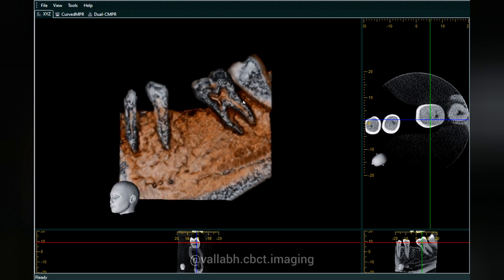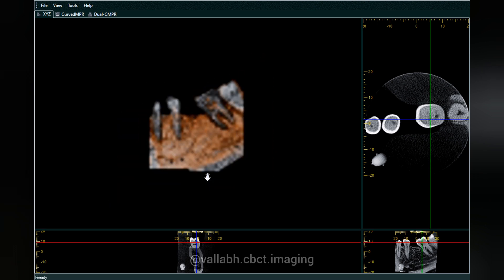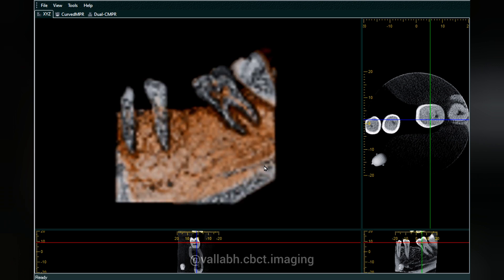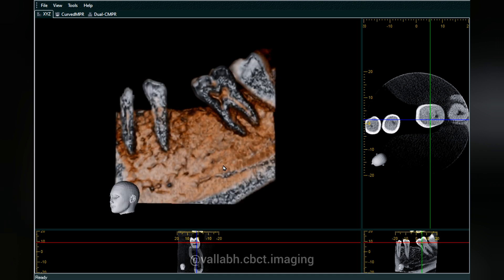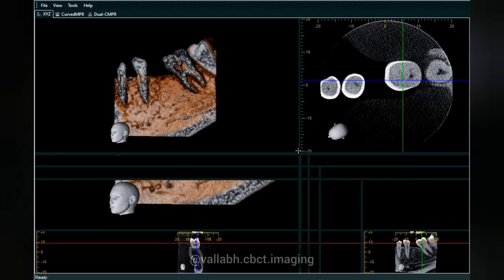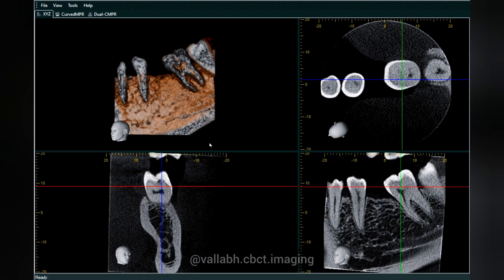This area is used to check the bone loss region — bone loss in cases of periodontitis. This is the inferior alveolar nerve canal cortex. Usually the nerve canal passes from the lingula on the lingual aspect of the mandible and opens up on the buccal aspect at the mental foramen. We'll approximately mark it here — this is the nerve canal cortex.